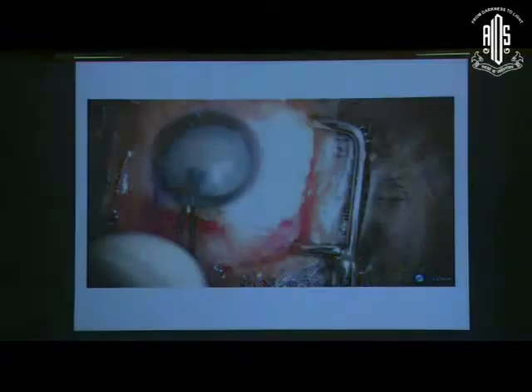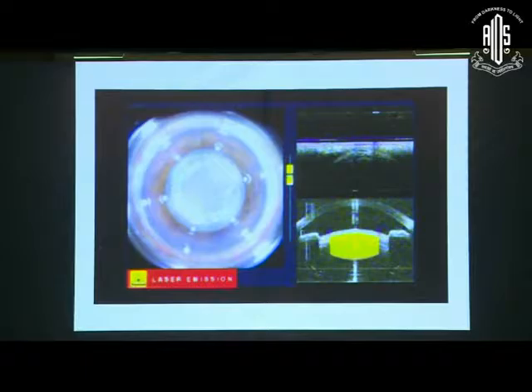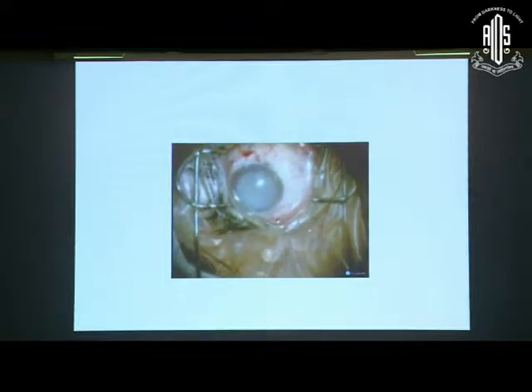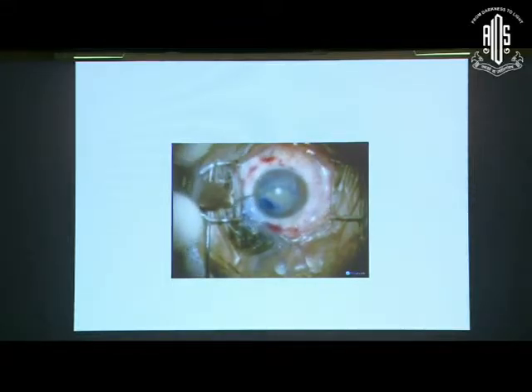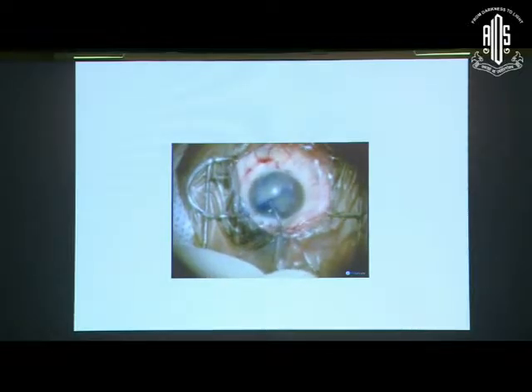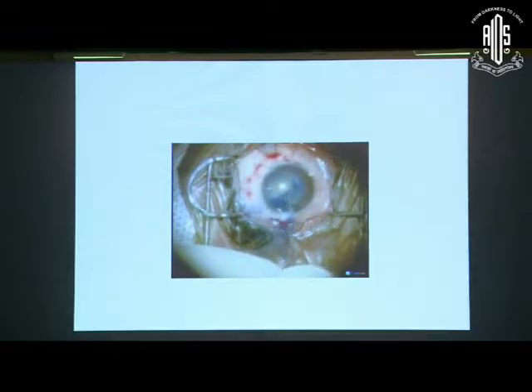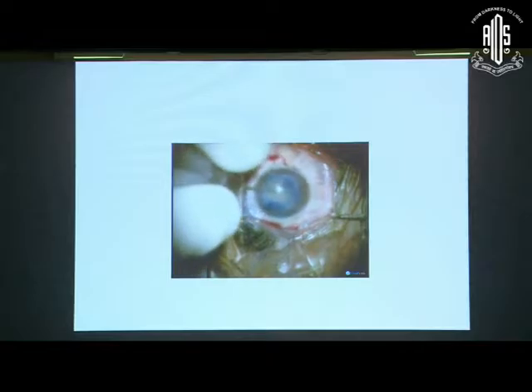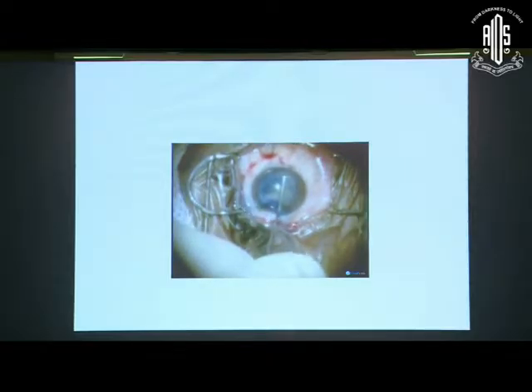Now, coming to what we can do with FLACS. This is an intumescent type where you would find there is suddenly a volcanic eruption, as if a real volcano has erupted. In all these white cataracts, I stain with trypan blue and always consider that tags are present. You should proceed in a very slow, phased-out manner. Here, you would see that I thought it was not fully done, and then completed the capsulorexis considering that the tags were there, and completed the procedure without any issue.